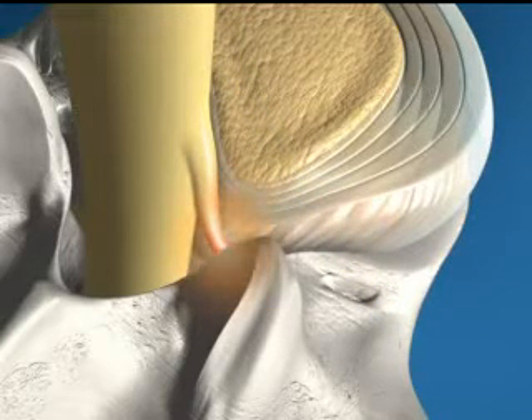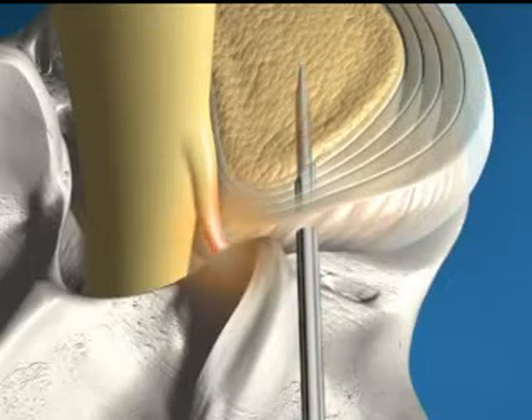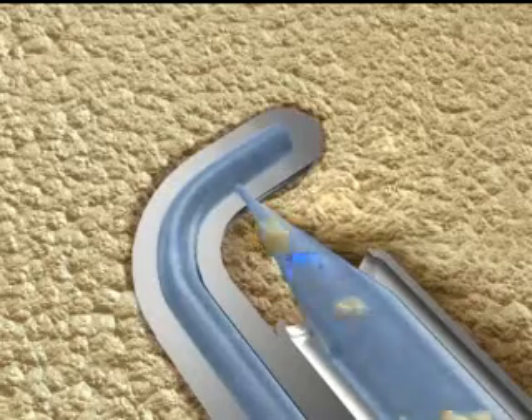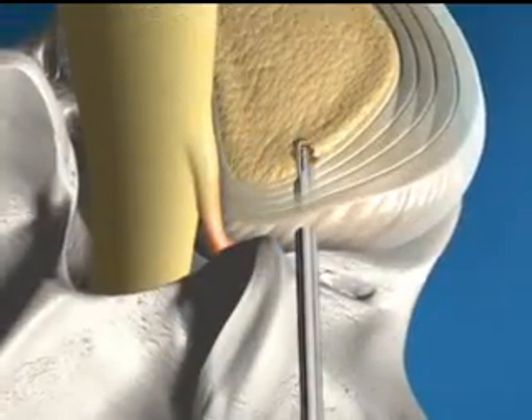The procedure begins when a small cannula or guide is placed into the herniated disc, allowing access for the spine jet micro resector. The unique spine jet micro resector uses a high velocity jet stream of sterile water to quickly and safely remove a small amount of the disc nucleus, reducing the herniation and relieving pressure on the irritated nerve root.